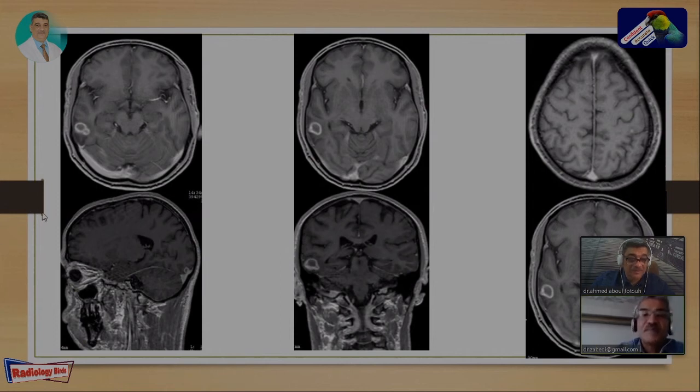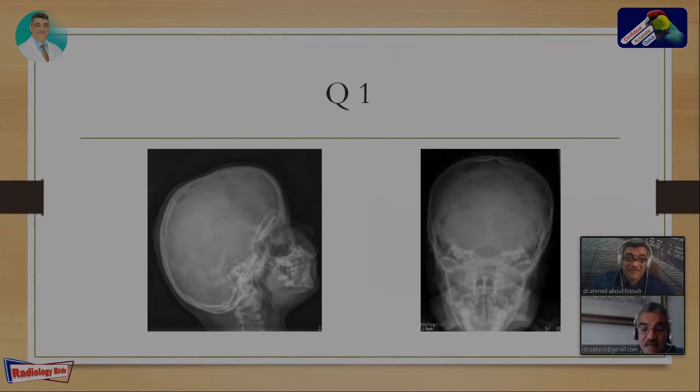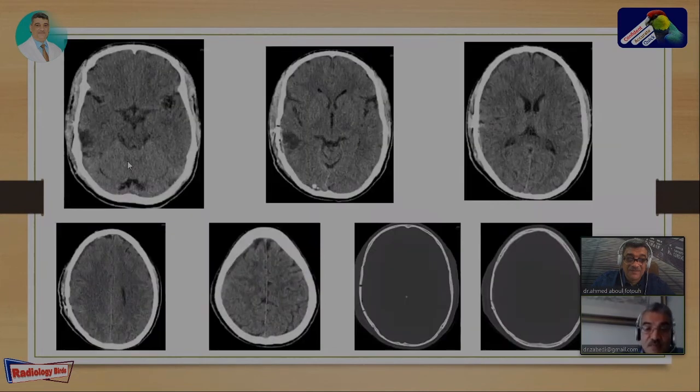We can change that. And then, of course, they sent the patient to another hospital, which is only a neurosurgical center, not far away from us. And they did the operation, as you see, this is after a craniotomy, and they said it's not tuberculosis. What do you think, what can it be?